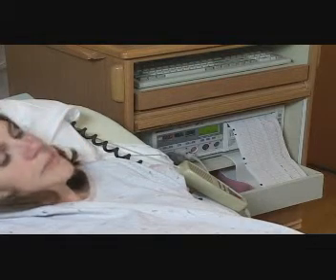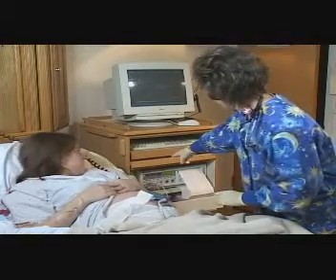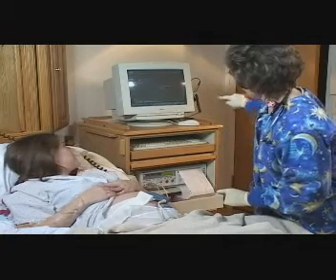When you are monitoring a client who is in labor, you are responsible for identifying and interpreting changes in fetal heart rate patterns. When you see a non-reassuring fetal heart rate pattern, such as loss of variability or late or variable decelerations, you must intervene appropriately.